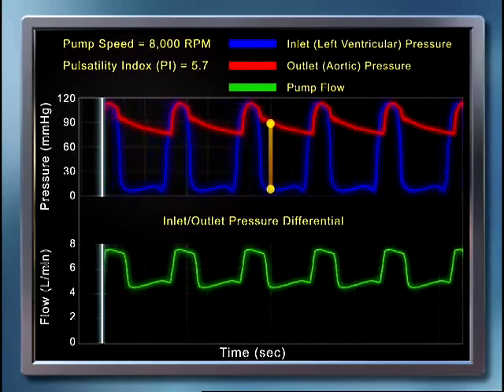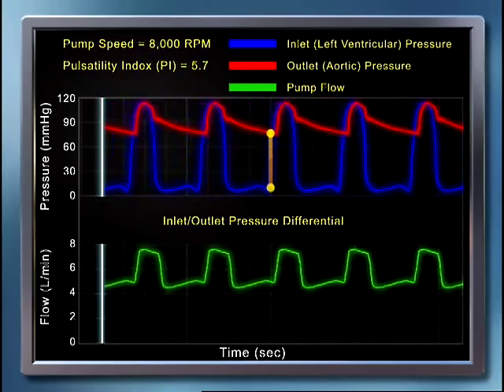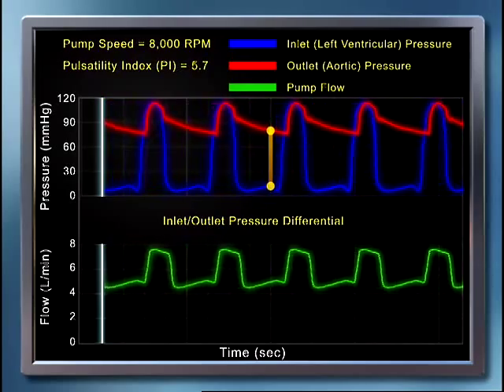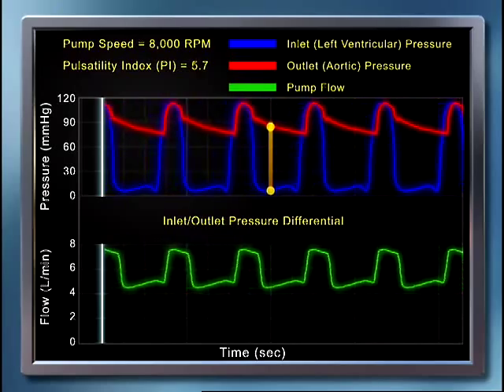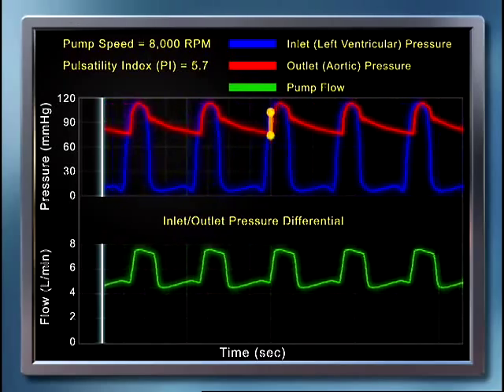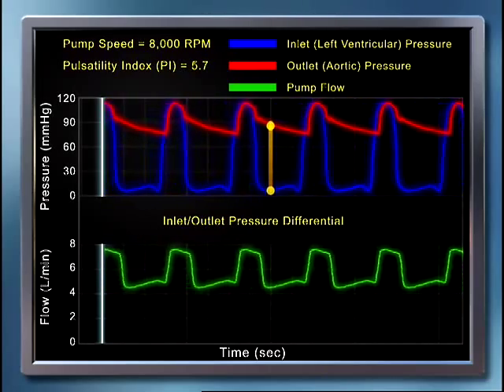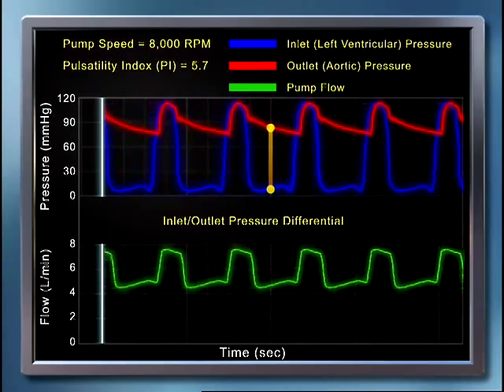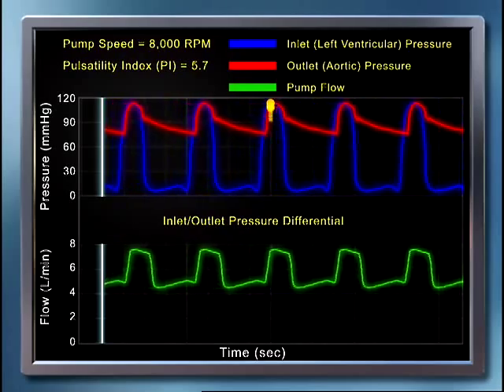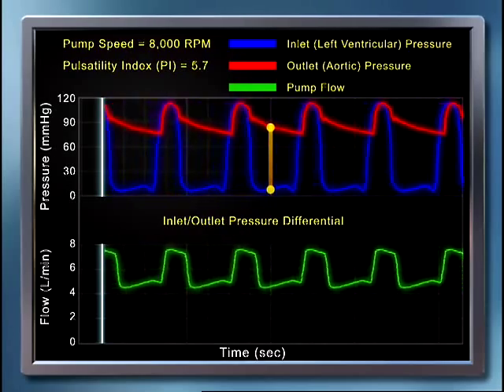In other words, for the example shown, during cardiac systole, the blue waveform — LV pressure — rises and is essentially identical to the red waveform, aortic pressure, which results in a decrease in the differential pressure. This is shown by the yellow bar becoming shorter. As the pump inlet and outlet pressures become more equalized, it becomes easier for the pump to propel blood forward, and therefore pump flow increases. This is shown by the increase in flow on the green waveform.